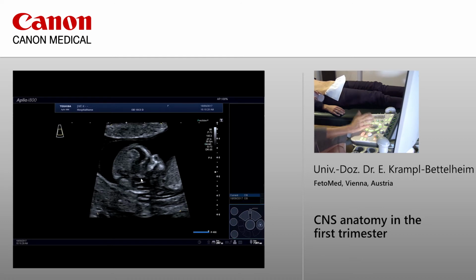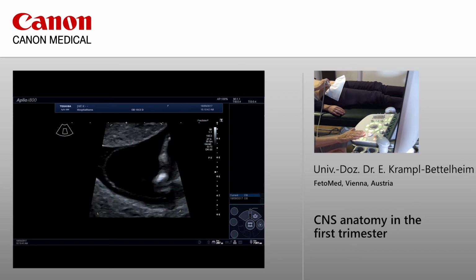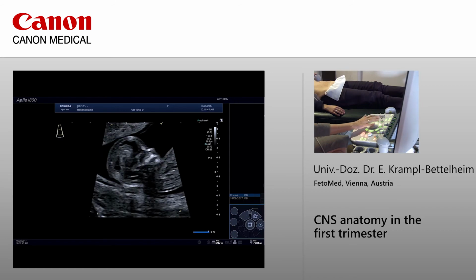And the most important thing now clinically to look at is your brainstem here, and you would always be able to find that quite easily, because you'd find the thalami here in the mesencephalon, and then it looks like a continuation. Here would be your aqueduct, and in continuation, the pons here, you would always find that quite clearly, and then the line, the posterior border of the pons, to the next very clear line, which is the occipital bone.